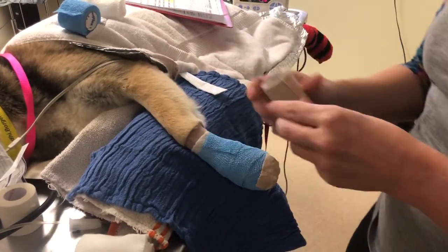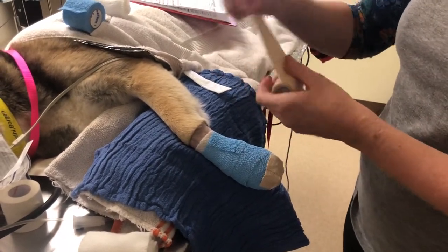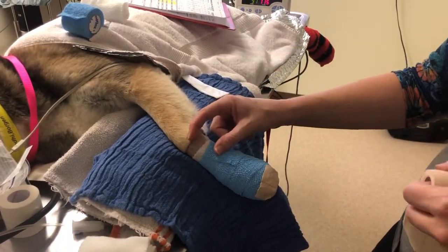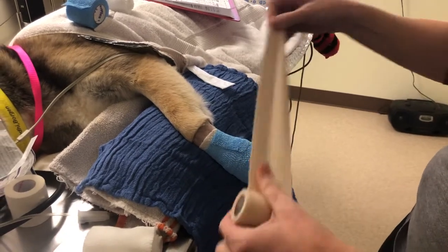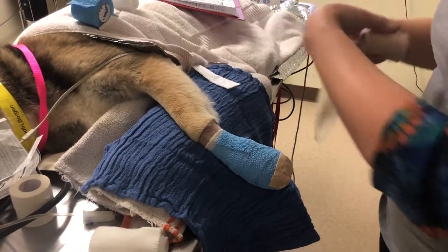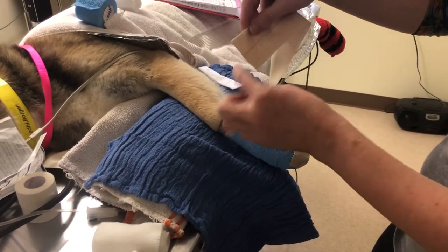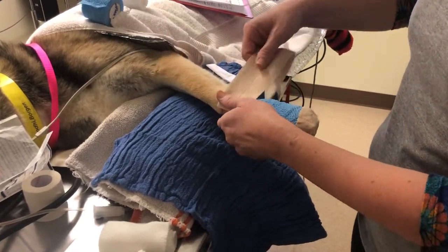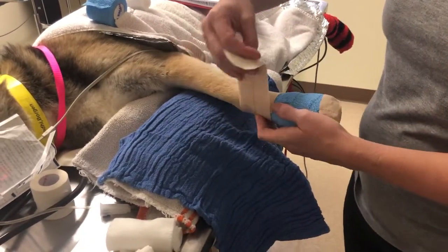This part is really critical: the elastikon is very sticky, has a little stretch to it, and can cut off circulation. So I'm going to use it half on the bandage and half on him so it holds the bandage on without letting it slide off. I cut the length first so I'm not tempted to pull and accidentally cut off circulation. I lay it on very gently — I am not pulling tight at all.